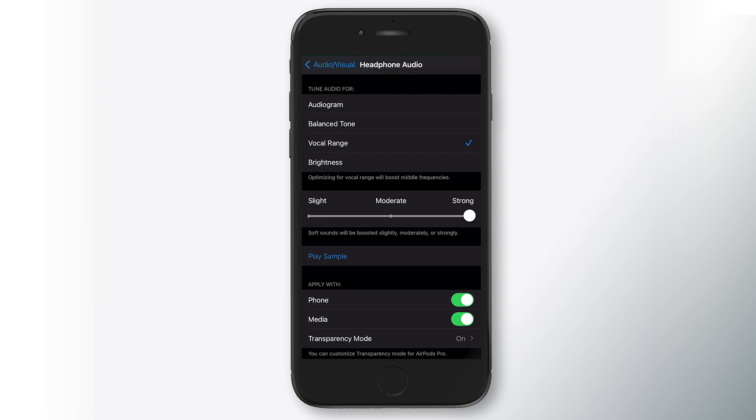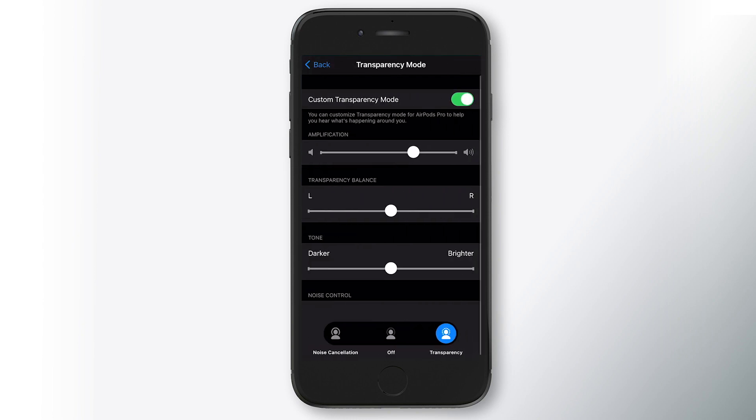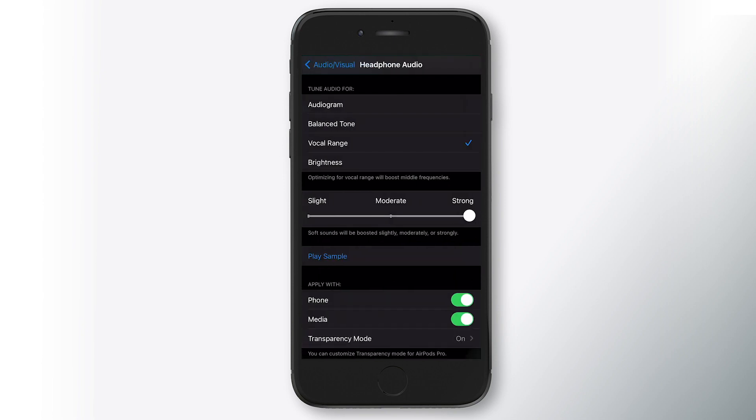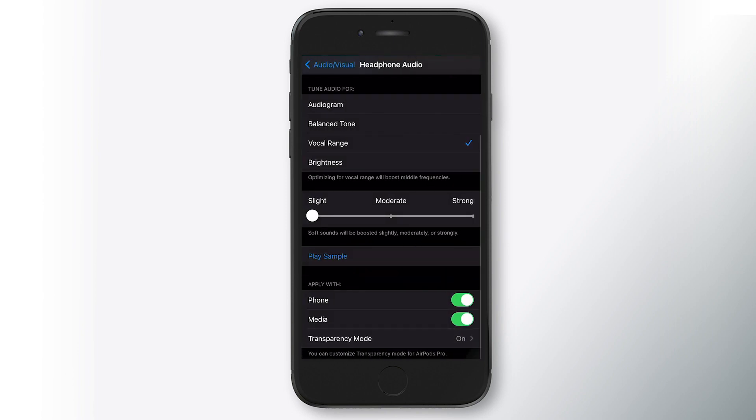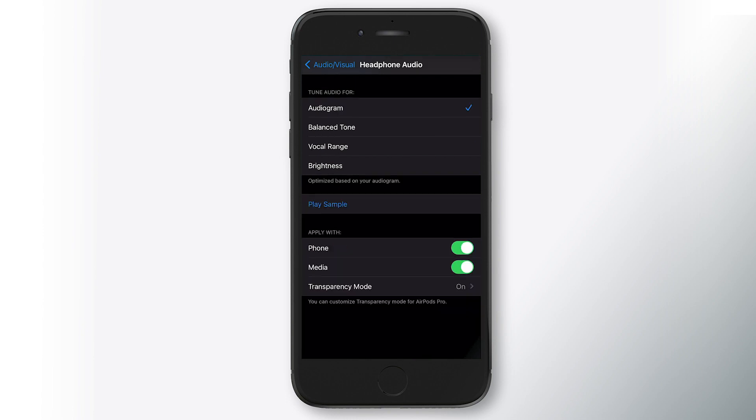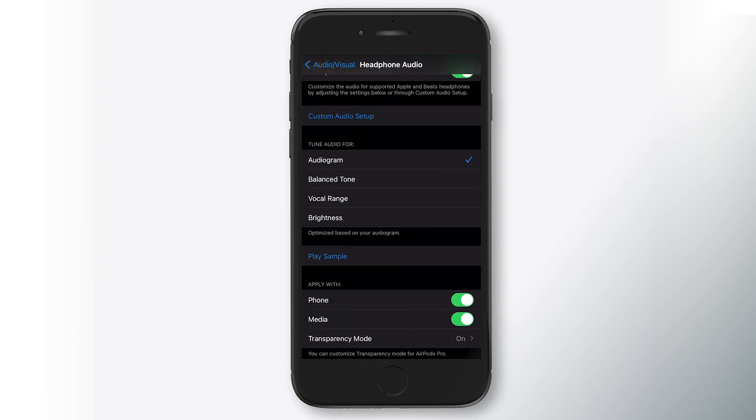We're going to keep this on vocal range. What you'll notice here is now that if you turn this up to strong, you go into transparency mode and you can still adjust your custom transparency. So you can boost that all the way up. And that is super loud right now. So I'm going to take that back down. What I've heard from people, they've gone in and they've clicked on vocal range and it defaults to slight. And then they go into custom transparency and try to crank up the volume. And they're like, it doesn't give me enough boost. I still can't hear. The reason that's happening is because you're still on the slight here. So you need to come into here and switch that to moderate or strong, and you'll notice a vast difference in how it sounds. So I'm going to switch that back to my audiogram.